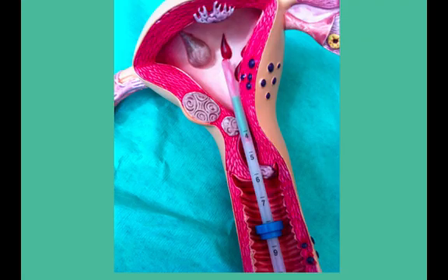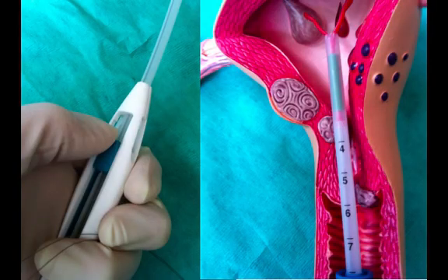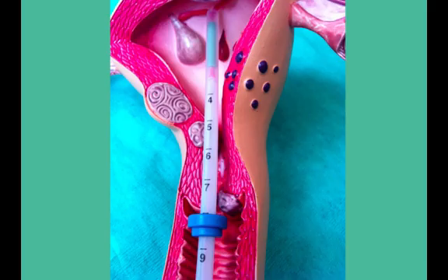Insert the device through the cervical canal until the flange is about one and a half centimetres from the cervix. Holding the inserter in position, carefully release the arms of Mirena by pulling the slider back until it reaches the mark, which is only one centimetre back. Push the inserter gently inwards until the flange then touches the cervix.